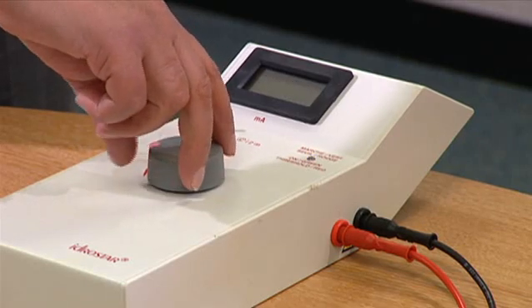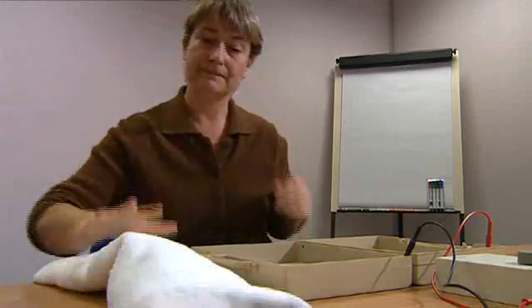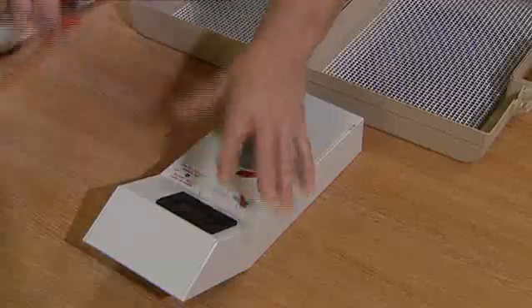When treatment is complete, turn off the machine and thoroughly dry all parts and pack away until the next treatment session. If you have any further questions, please do not hesitate to contact STD Pharmaceuticals.